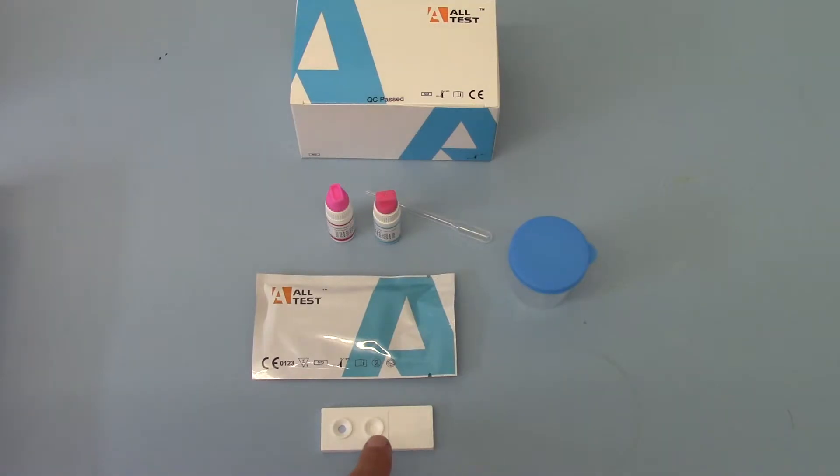Now what you're looking for is the color that forms in your sample well A. For a normal or positive result indicating that there are over 15 million per mil sperm in the sample, the blue dye that forms in sample well A should be darker than the blue dye showing in sample well B.